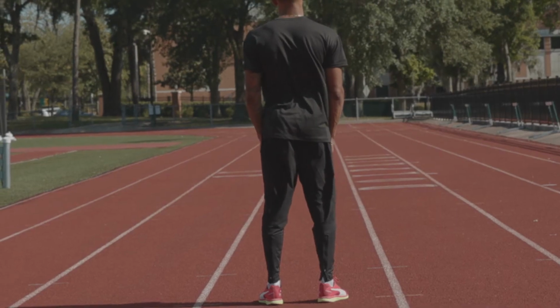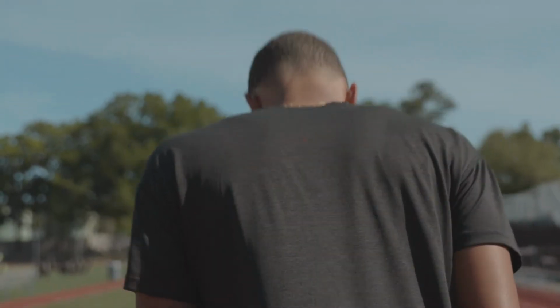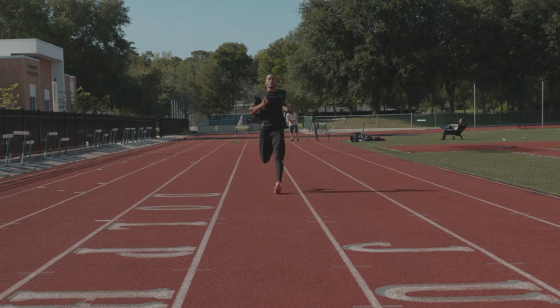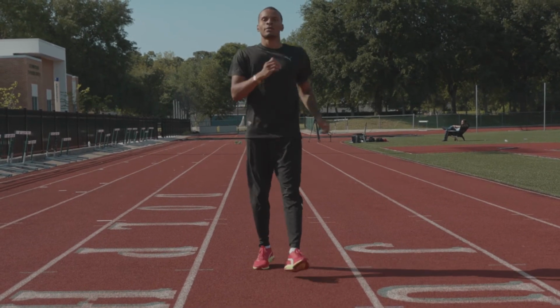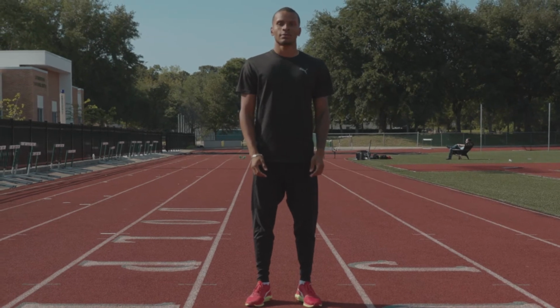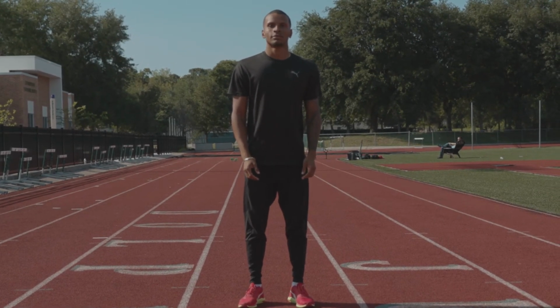The athlete begins the test on your command and runs with their self-chosen gait strategy at a rating of perceived exertion of a 6 to 7 on 10 or a 60 to 70% effort. Instruct your athlete to accelerate through to 10 meters, maintain speed through to 20 meters, and decelerate through to the end of the test. Make sure your athlete stands quietly for 5 seconds at the end of the test as well.